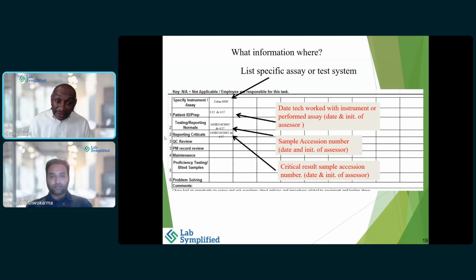Where it gets kind of squirrely is when you go to micro, you go to kit testing. Those you have to look at each one, because some they allow you to group together. We have a lot of kit tests now. We have some instrumentation that does RSV, flu, and COVID at the same time. That's one test system right there. There's no different sample manipulation or sample handling for that one test system.